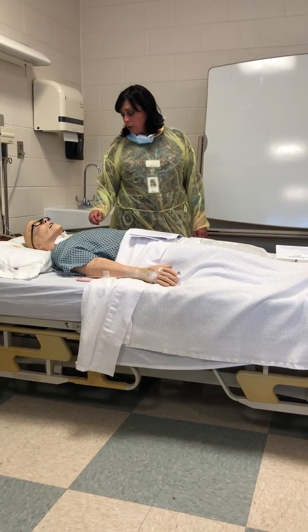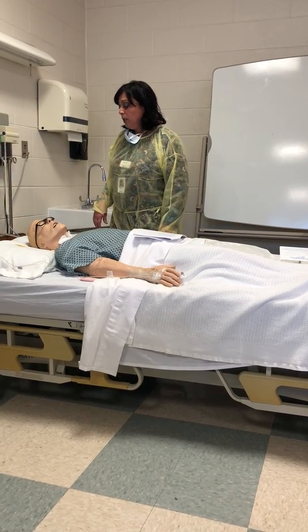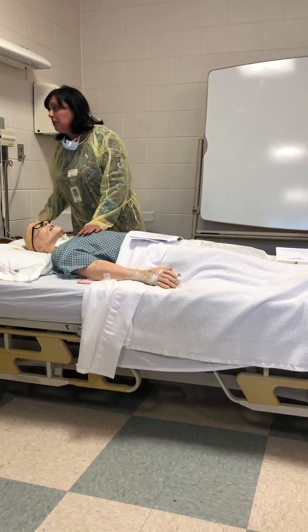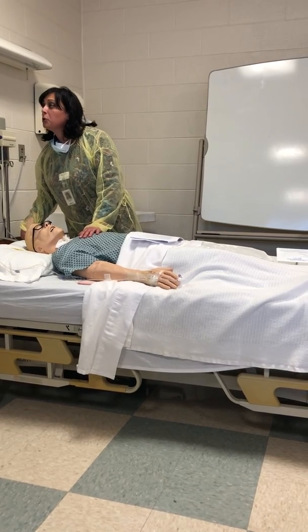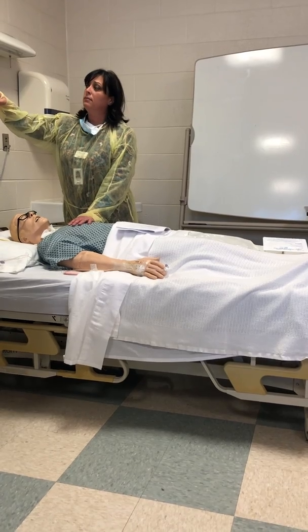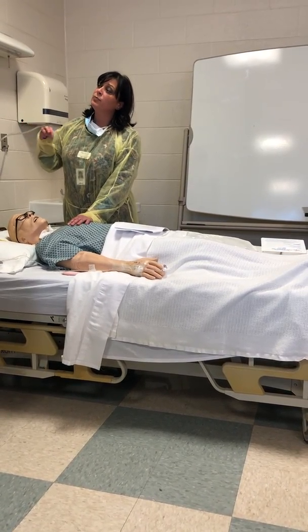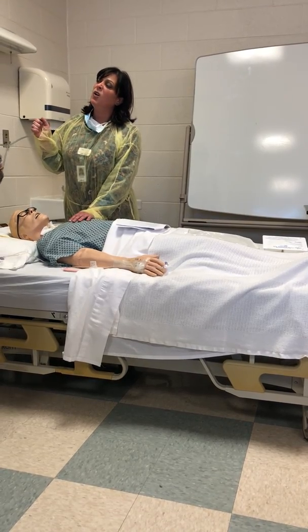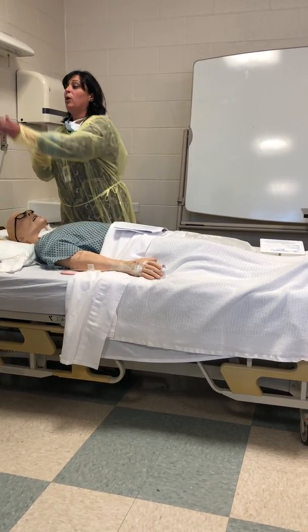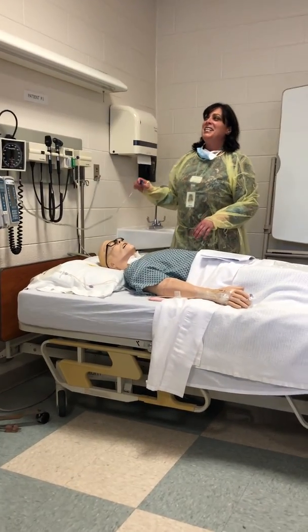Whenever you suction, you want to, oh, it's way over there. I poorly planned this, Mr. Kent. Oh, it's got a temperature. What do you mean? A suction thing, so we put it on regular. Okay, excellent, good job. Keep doing it. Keep going, Dennis.